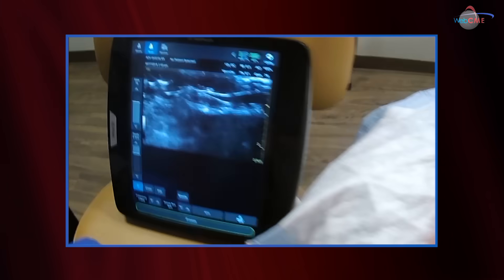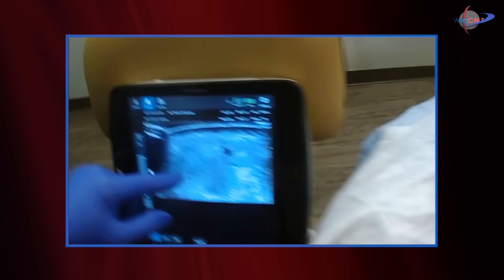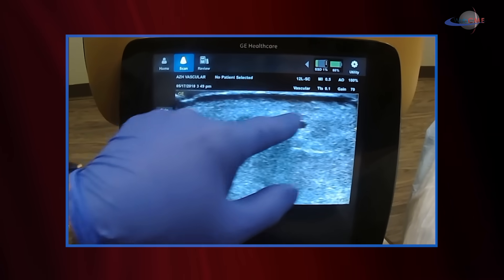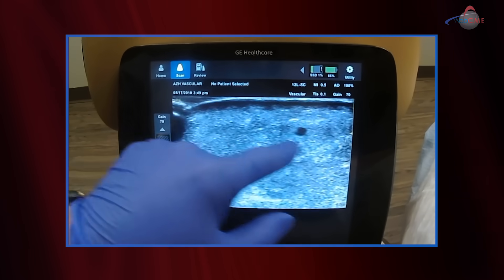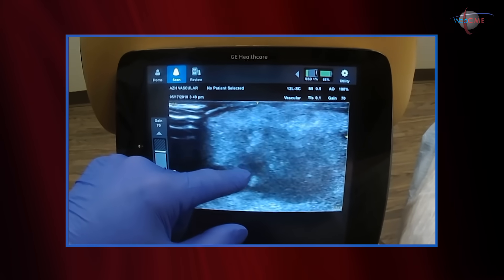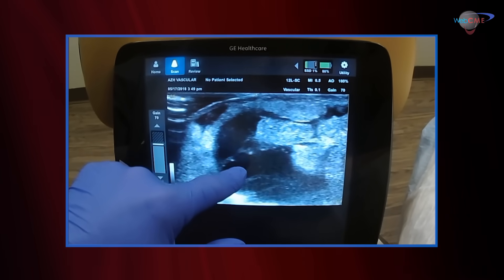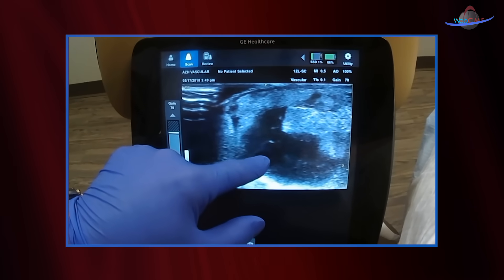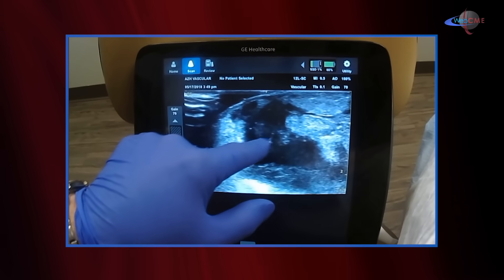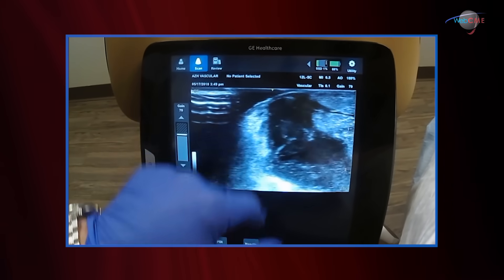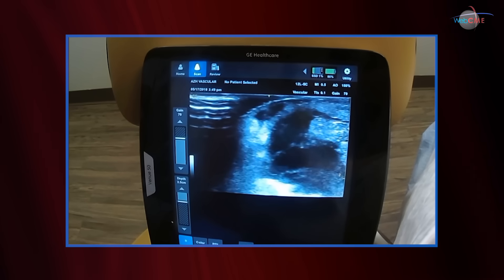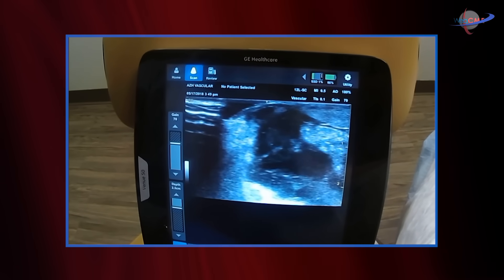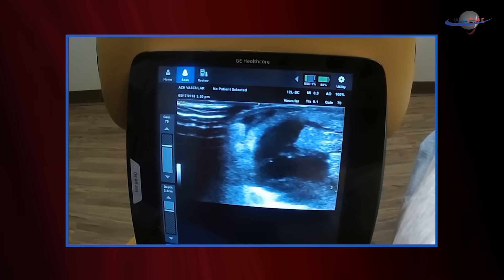If you look at the margins from a different angle — we have normal tissue here. As I come across that suture line, you'll see the suture line appearing right here. And as I come back over the flap, we'll again get into that area of ultrasonic echoes consistent with fluid. It's sort of loculated here, but certainly this is consistent with a subdermal abscess, seroma hematoma — hard to distinguish at this time. So this needs to be taken care of and drained before we're going to have any healing here.